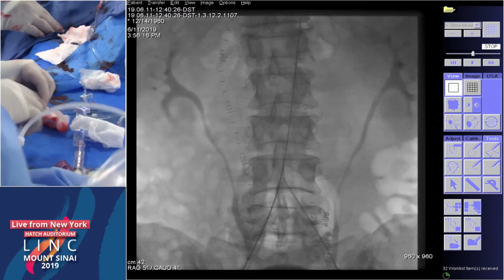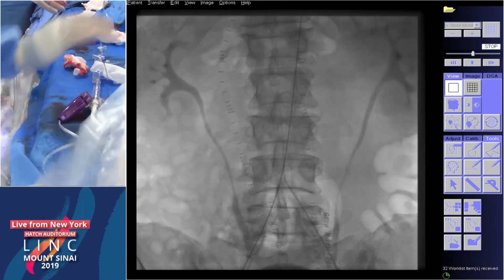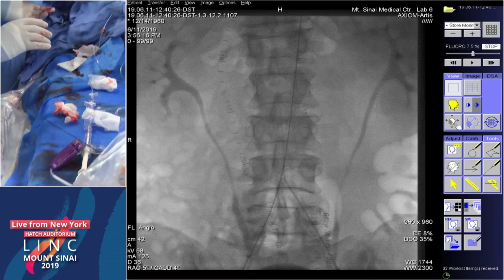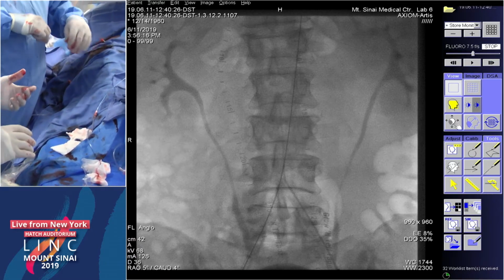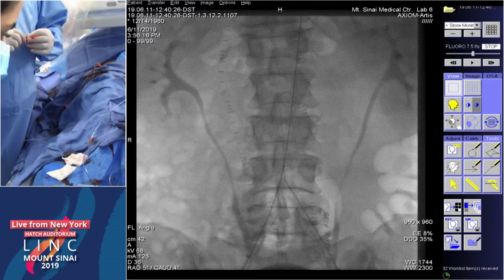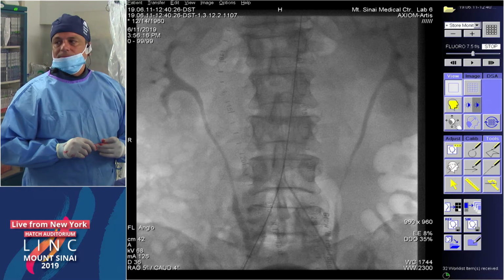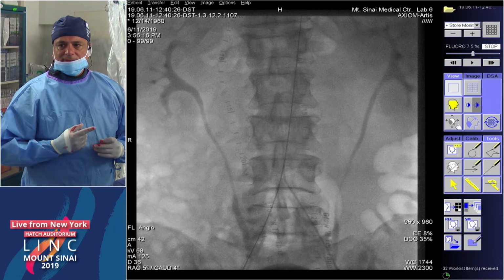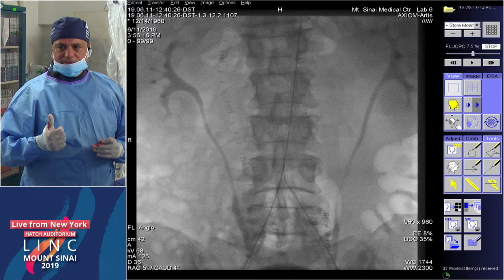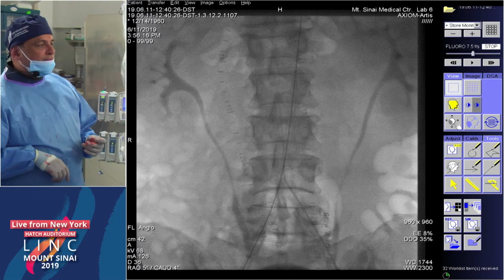I think you can be penny wise and pound foolish here to give you the best long-term result with this. Because you've done a nice job. You don't have to put a lot of pressure in there. Just go in very accurately, deploy the distal aspect of your stent, and I think you'll be golden. 30 minutes is fine. The risk of restenosis in iliac stents is relatively low compared to, let's say, SFA. So I would definitely go ahead and stent it. I think it's safe, and you have nothing to lose.